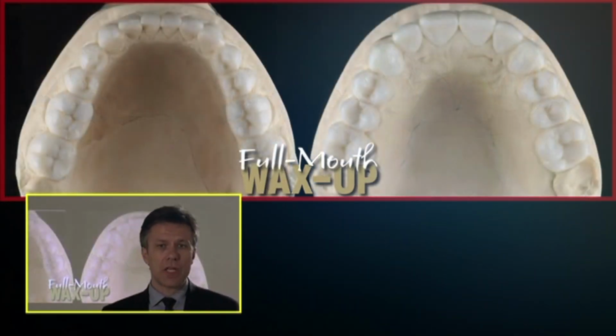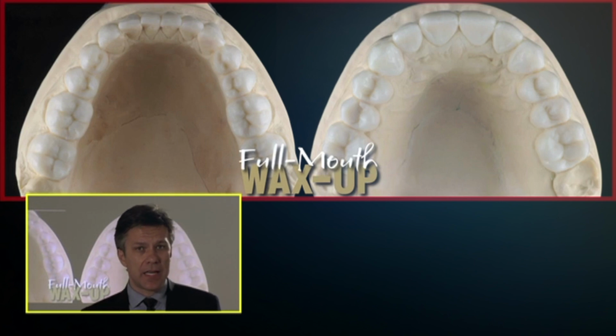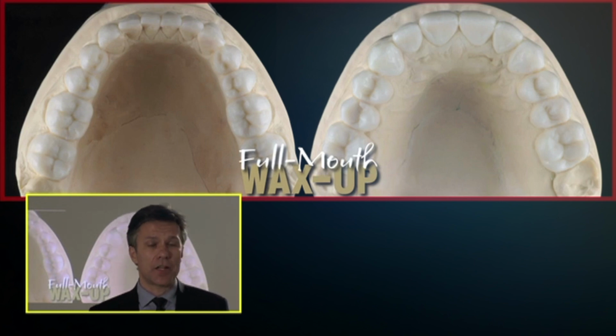Let me show you. Here we can see the full mouth wax up. It looks beautiful, but sometimes it's a lot of work. And once it's not approved, once you have to do some alterations, this means that we're going to spend a lot of time, and a lot of times a lot of money, redoing the case, redoing the wax up, because it is a lot of work.